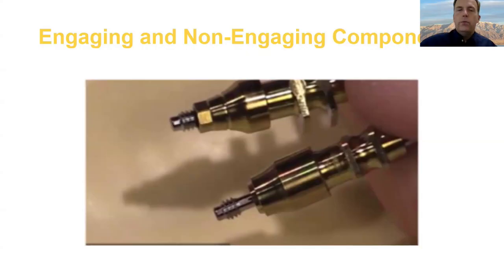So if we're doing a single restoration, which is either like a single tooth screw retained or let's say a 3-unit cement retained bridge, we'll want to use these engaging components. Whatever the shape is, the geometric shape that's in the platform, a square, a hex, a flower, then we want to make sure that this part perfectly engages.